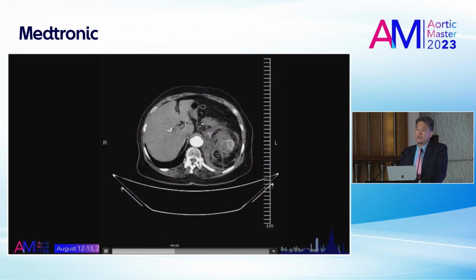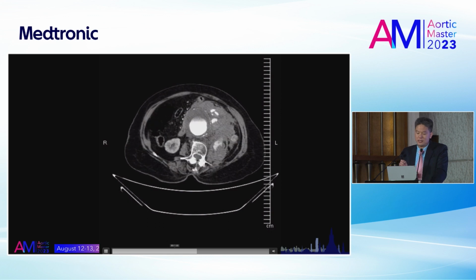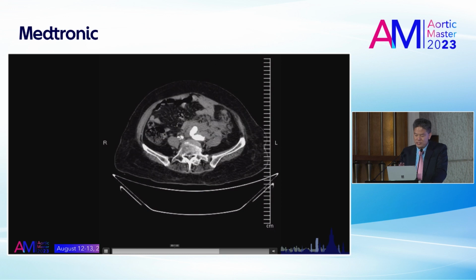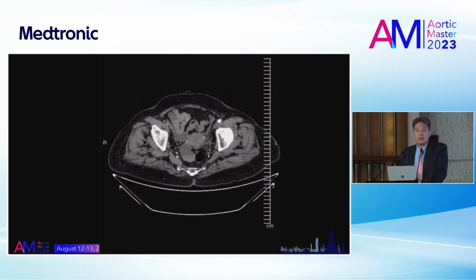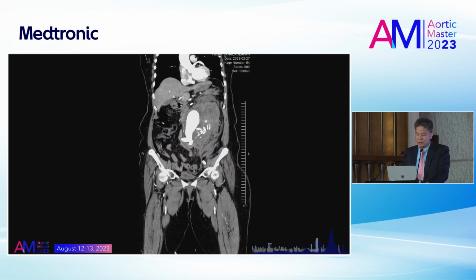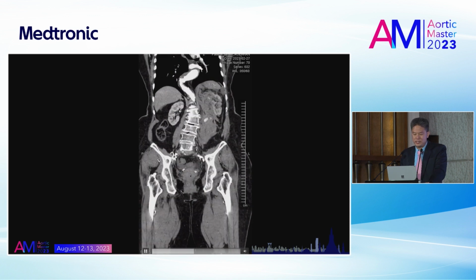Usually, if the patient is symptomatic, we could try to revascularize the iliac limb. But in the rupture case with the patient's syncope, you can see the contrast extravasation from the aneurysm. There's no time for revascularizing or recannulating the external iliac, so we decided to do an aortouniiliac procedure for this patient.